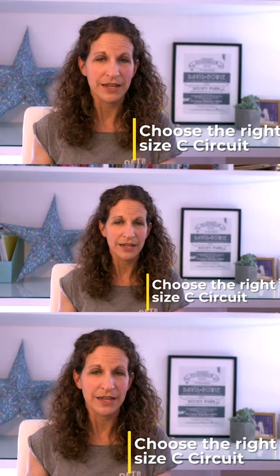Choose the right size C-circuit. Half a litre for infants, one litre for children, and two litres for adolescents and adults.